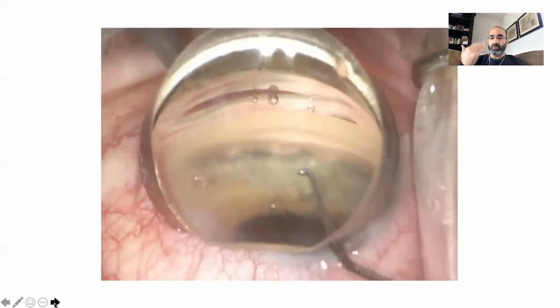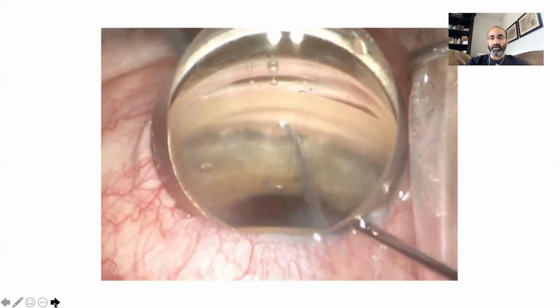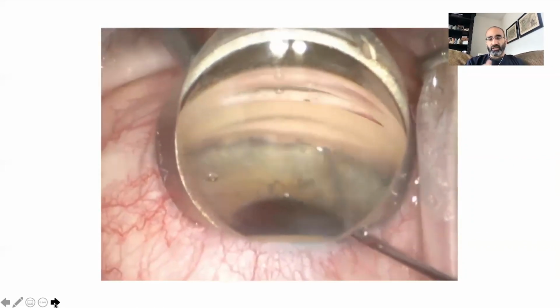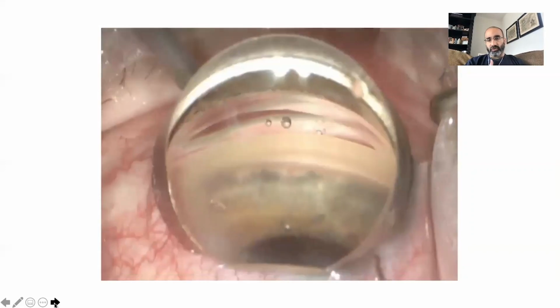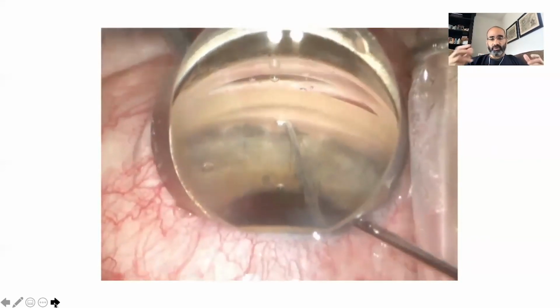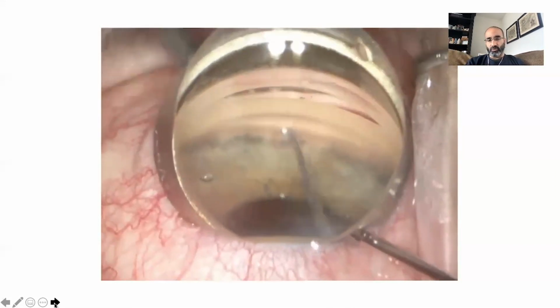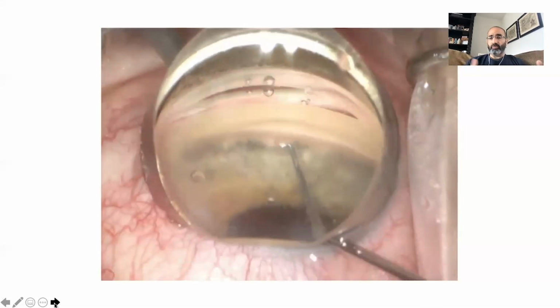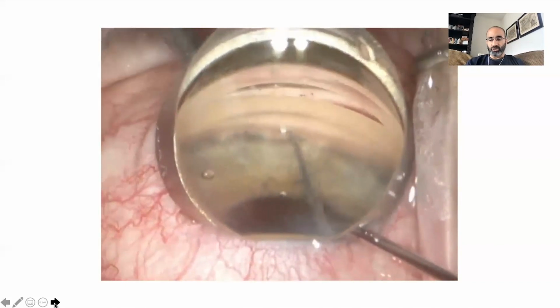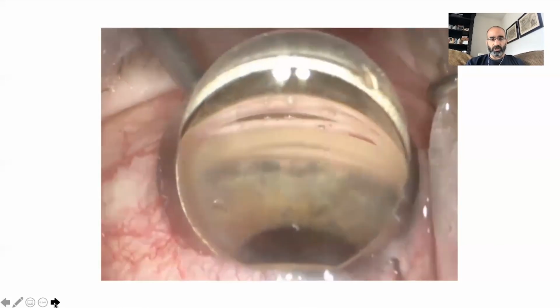Reposition the patient, reposition the microscope, and then take your chopper and go into the angle and act like you're doing the angle procedure. If you do that for about 10 cases before you do your actual first angle surgery case, you're going to be comfortable with the scope, repositioning of the patient, the motion that you're doing with your hand, and you also get the staff in the operating room accustomed to helping with repositioning of the patient and the microscope.